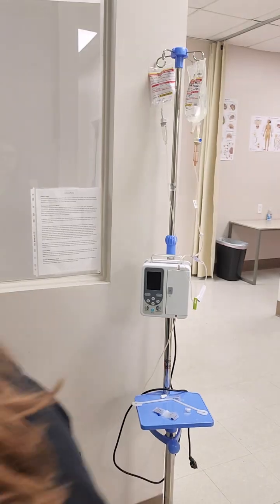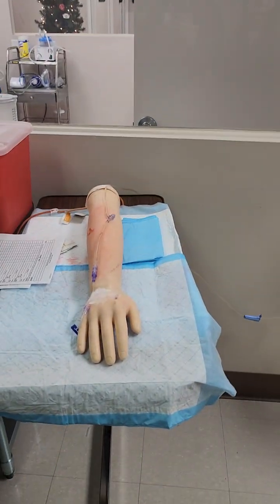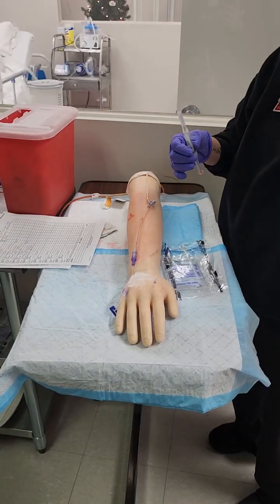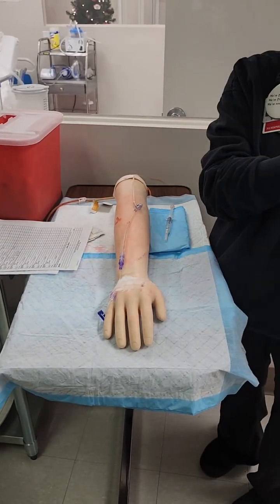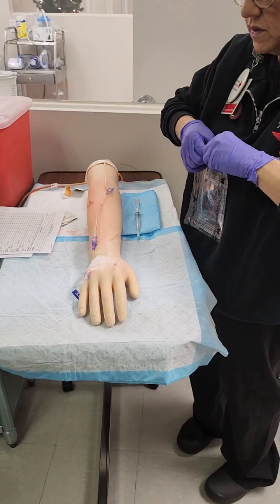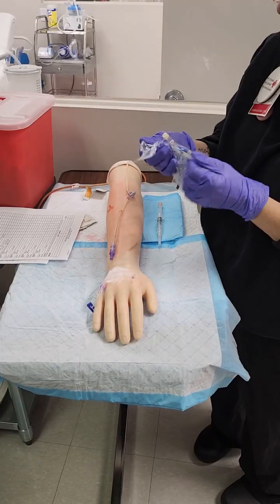Let me get my stuff here. But it tells me my Kefsol has to be mixed in an IV solution, okay? So I have a pre-filled syringe from my pharmacy, and I'm going to mix it in 100 milliliters of 0.9% normal saline. So check my medicines 3 times. I'm going to open this up, check my expirations, identify my patient.